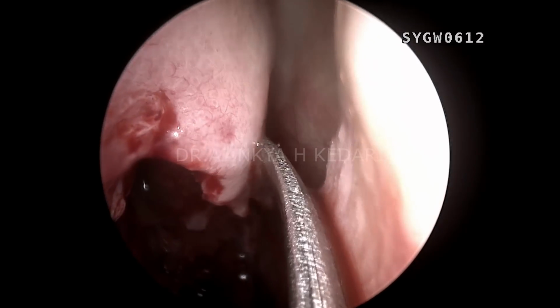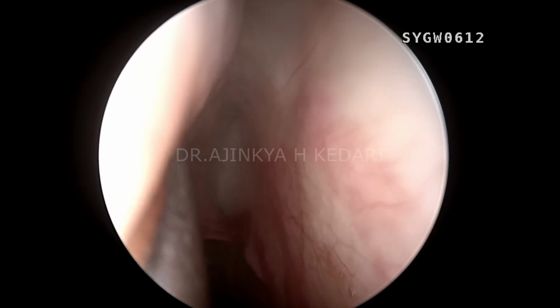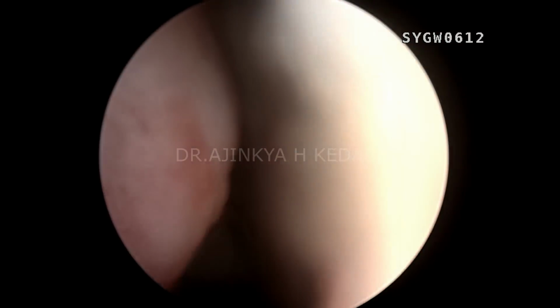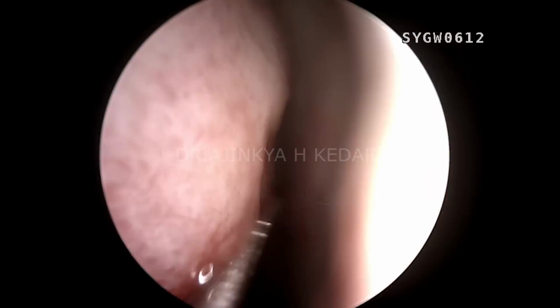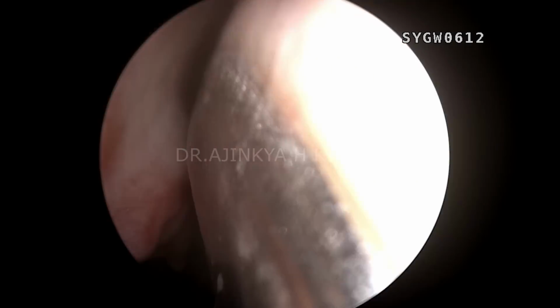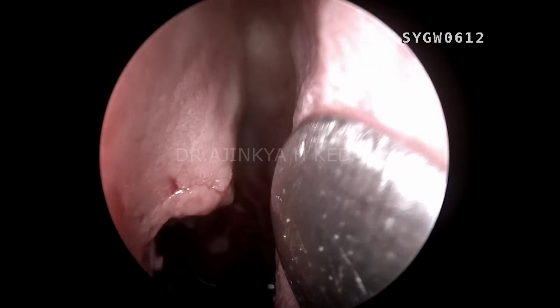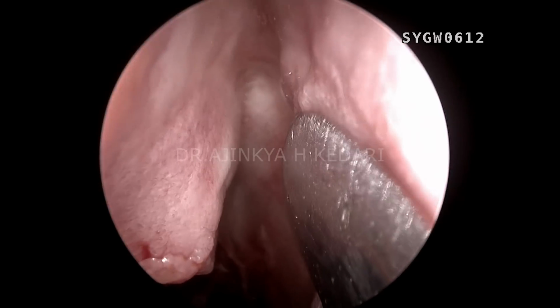That's the middle turbinate, upper one-third, you can see right there. And that's the area of the cribriform behind, where you can see the cribriform mucosa. That's the olfactory mucosa right there. But anteriorly will be the floor of the frontal sinus. The aim here is to elevate the mucosa and reach, see that's the olfactory epithelium right there, the yellowish white, and anteriorly is the floor of the frontal sinus. Where my Freer is right now, exactly at that level, will be the floor of the frontal sinus, a little behind. By pushing against that septum, I have made more space inside.